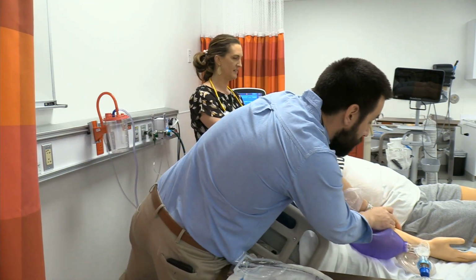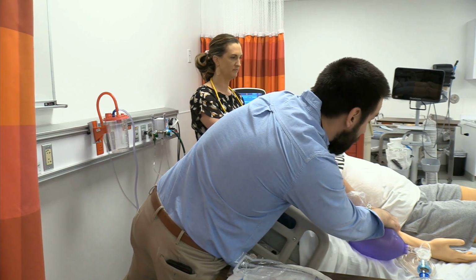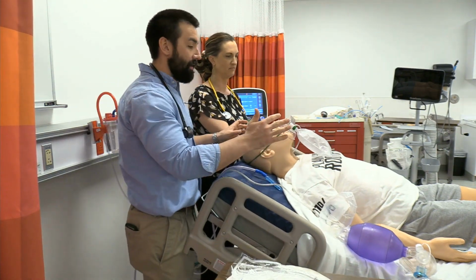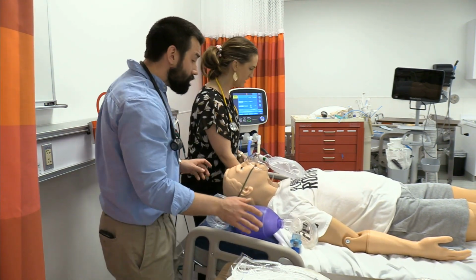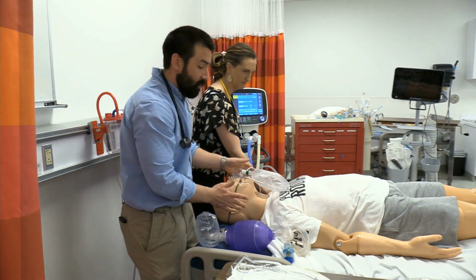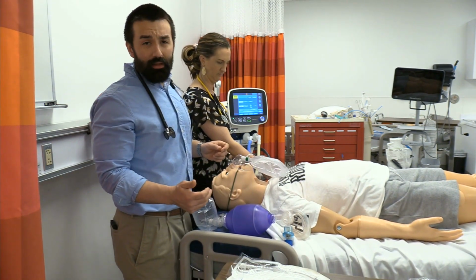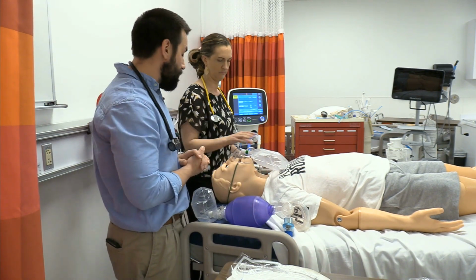Okay, so I'm giving the drugs, so fentanyl, followed by our induction drug, so a little ketamine, and then the rocuronium. Once we get those drugs in, we're going to go ahead and take a little bit of time, about a minute here, get everything in. At that point, we're going to go ahead and lay them back down here. At this point, too, we could go ahead and pull them forward if we needed to. You could raise the bed up so you're not all hunched over. I'm actually going to do that. Yeah, that's fine. And to accentuate that head tilt chin lift, you could also roll up a towel or put something behind the shoulders to really exaggerate that if you needed to.